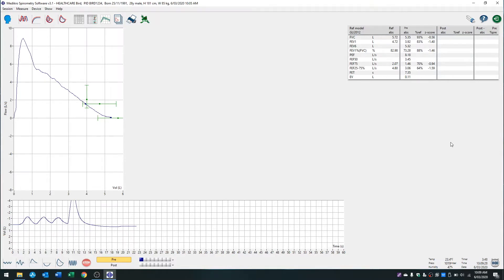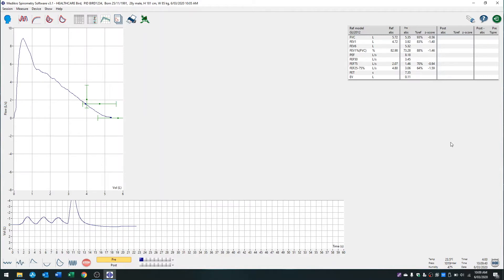You can see here that we're already on the testing screen and I've done a spirometry trial already. A previous screen, which was explained in the previous video, includes how to enter patient information—height, weight, gender, etc.—which are important for performing spirometry.